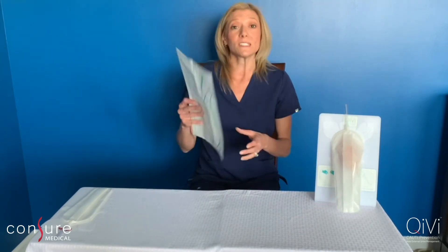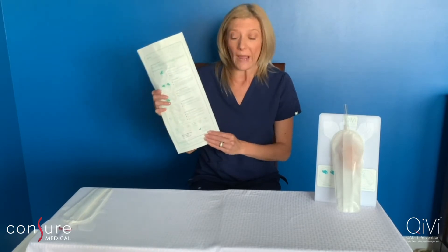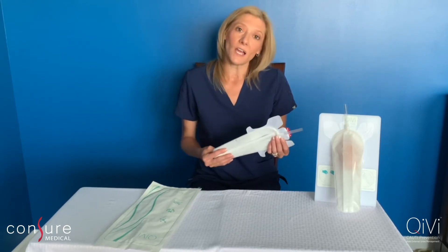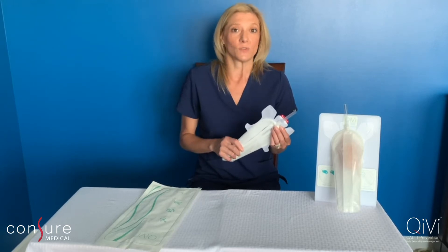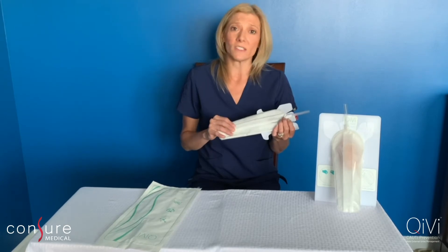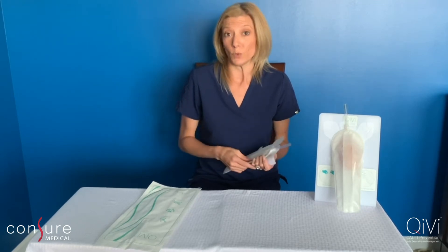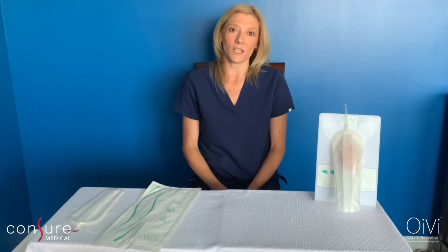QV comes in a single-use pouch and has directions with pictures clearly on the back. The device is intended for male patients with urinary incontinence who are semi to non-ambulatory. The device should not be used on patients with female anatomy, if they have an allergy to any of the device materials, urinary retention, or penile complications like lesions or wounds. For a full listing of contraindications, please refer to the instructions for use manual.